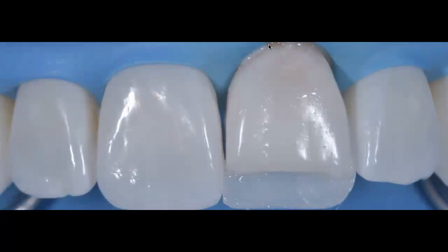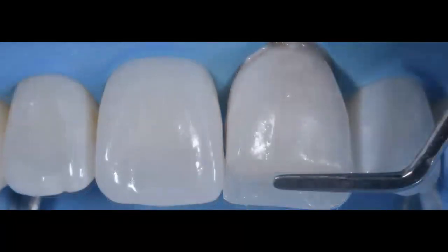Here I'm placing, as you can see on the cervical third, that opaque flowable layer of composite, so that I can hide a little bit of that translucent area that was created there because of that thin enamel. And now I'm going to start placing my dentin. And my dentin, again, I'm using the OBL, which is an opaque bleach shade.